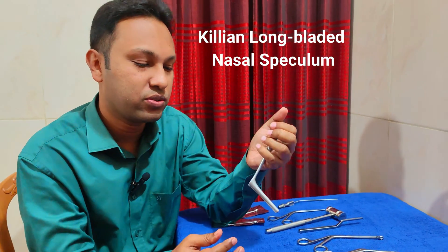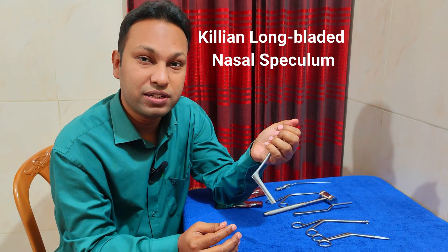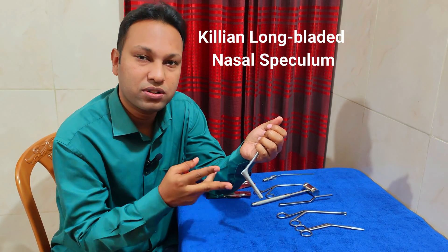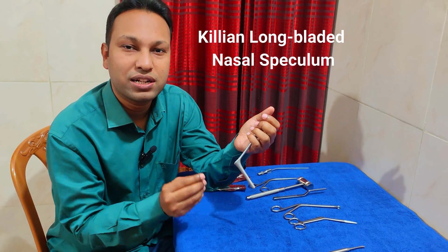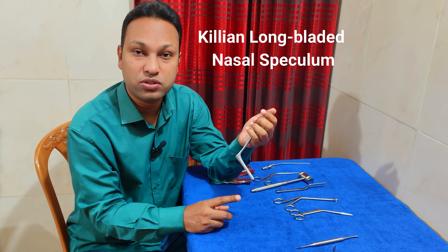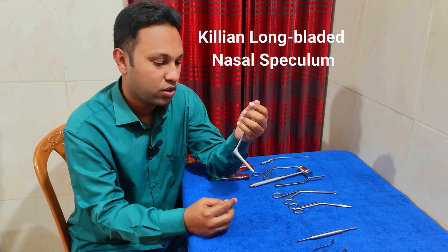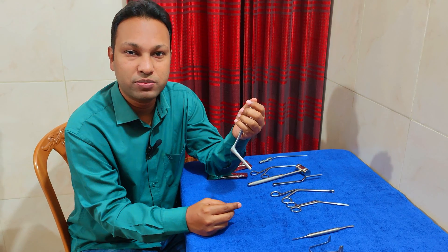We insert the Killian's speculum into the nasal cavity for instrumentation purposes. It helps us for proper instrumentation within the created space. It is also useful for packing the nasal cavity and during giving quilting sutures over the nasal septum at the end of the surgery.